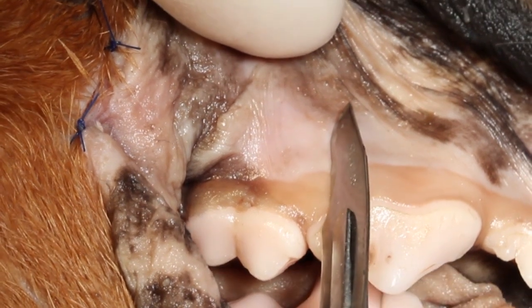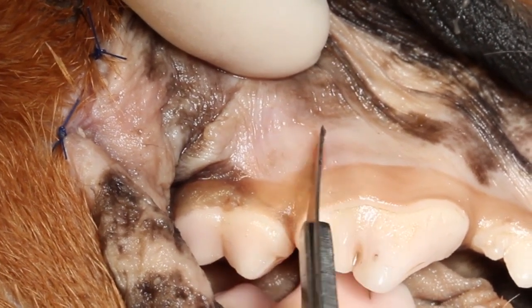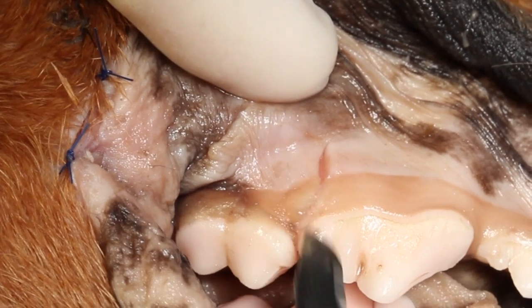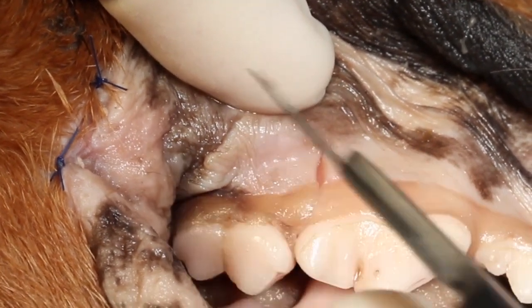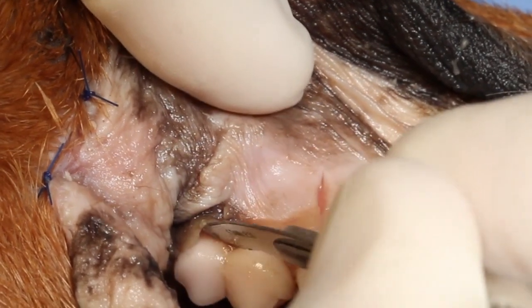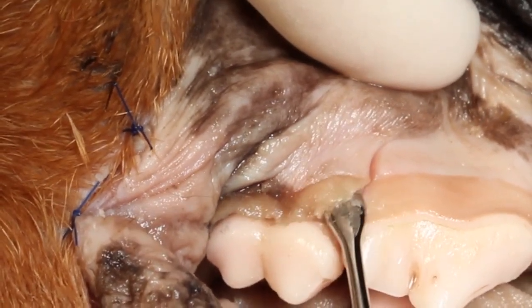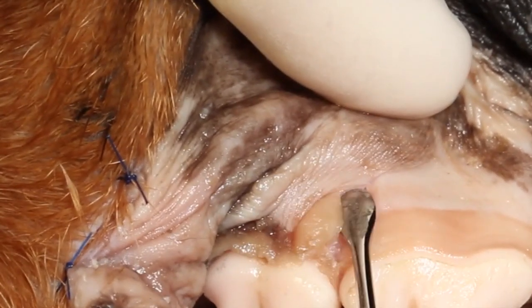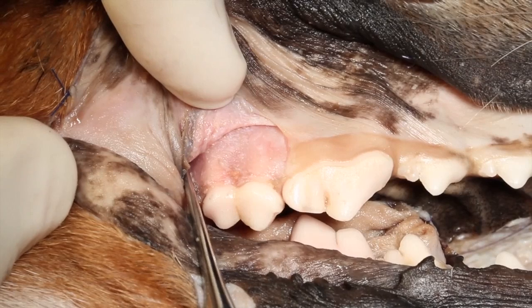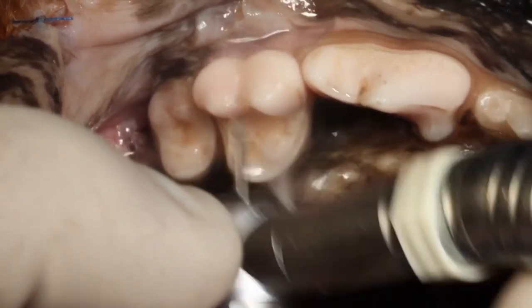We'll start by demonstrating a mucoperiosteal flap for proper exposure to extract this tooth. We begin with a mesial incision and carry that on to just past the mucogingival junction. We're using our scalpel blade to start the incision through the length of the attached gingiva. This helps to decrease flap trauma with the periosteal elevator, as that elevator can very easily be passed apically and cause trauma to the flap. Starting with the smaller, thinner blade and then progressing minimizes that potential, exposing the vestibular bone.